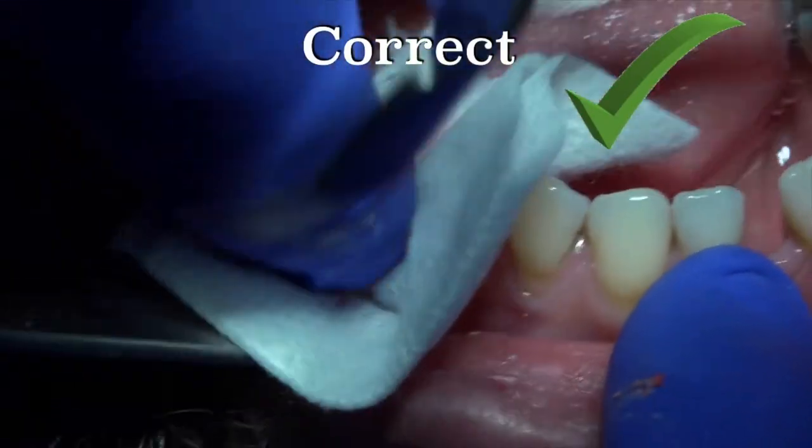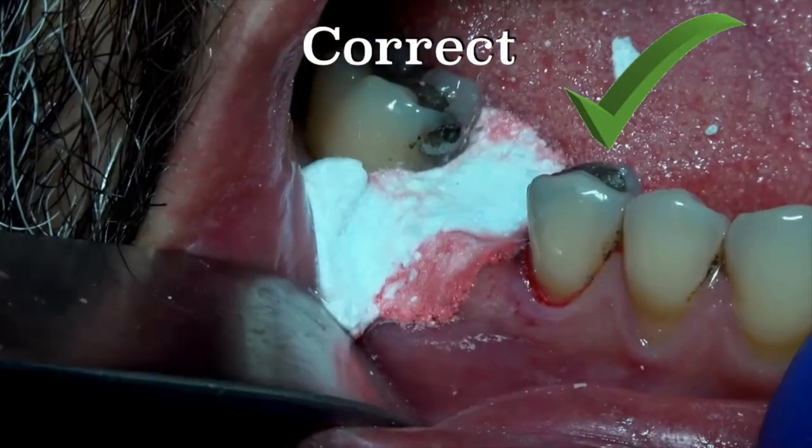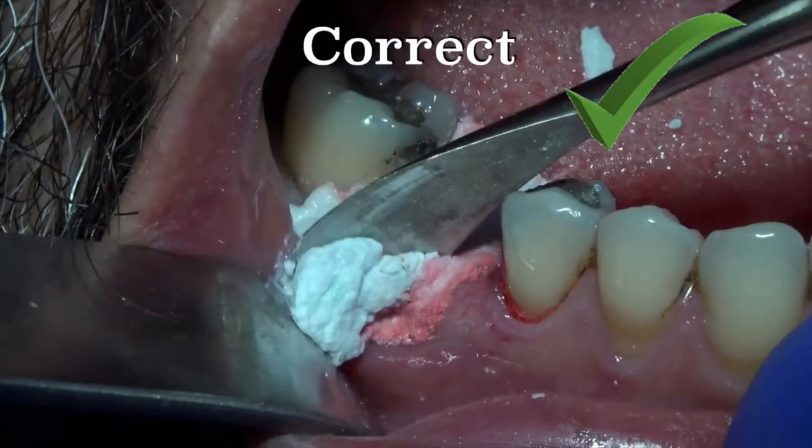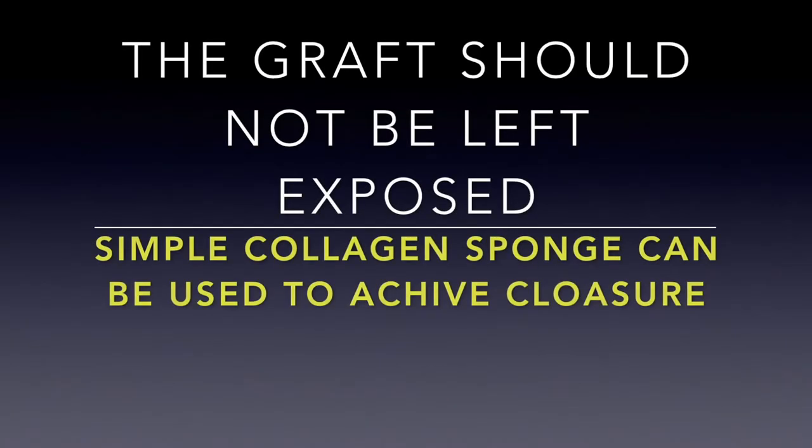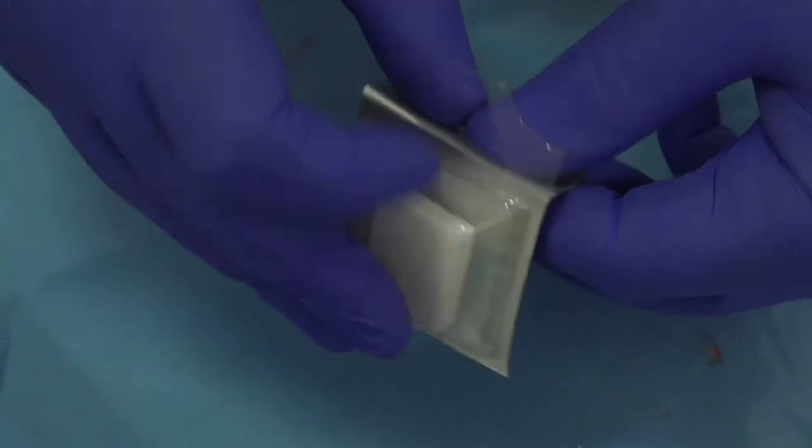Eject the material directly into the grafted site. Press firmly for 2 seconds. Remove the cement excess. And then you must protect it with a simple collagen sponge which must be secured with the surrounding soft tissue.